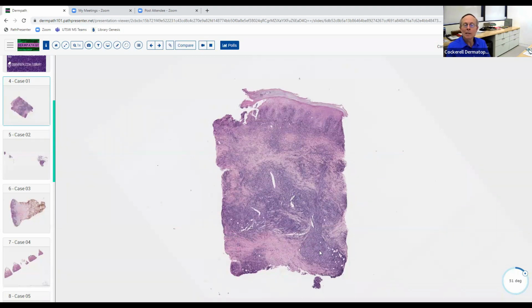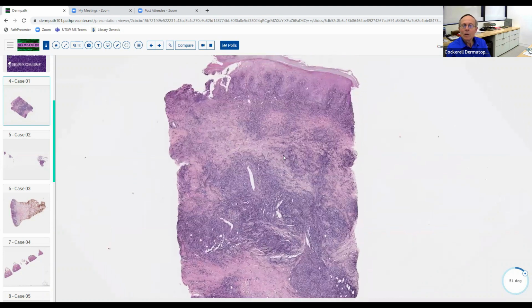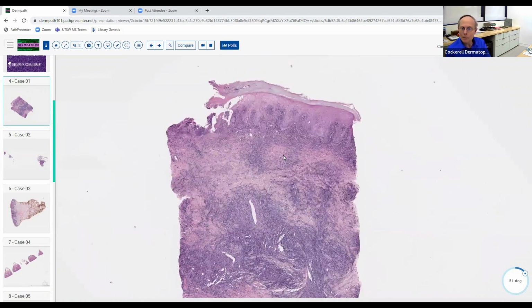I think a lot of them are lymphocytes. It looks to me like some of them are a little paler down here. So there's probably going to be some histiocytes in here also, just at low power. We're going to obviously confirm that as we go to higher magnification, but lymphocytes and histiocytes. So if it's got histiocytes predominating, what do we call that type of inflammation?